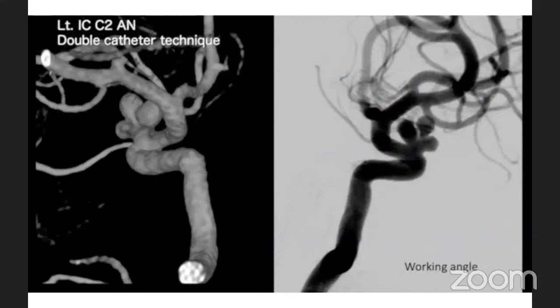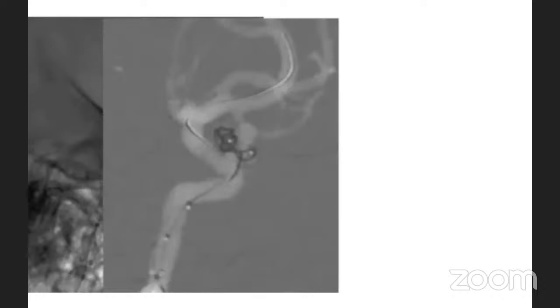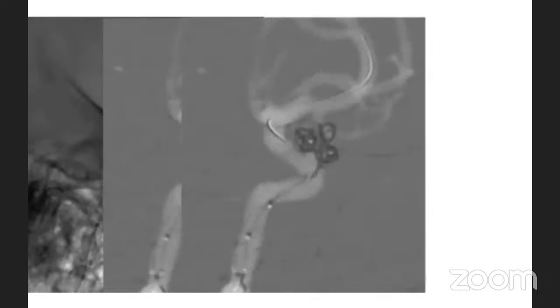This case is unruptured IC paraclinoid aneurysm. The shape was irregular like a clover, so coil framing is very difficult. Double catheter technique is useful for such a multilobulated aneurysm. Two microcatheters were inserted into the aneurysm. The first coil was inserted but still unstable. A second coil was inserted from the other catheter before detachment of the first coil. Stable frame was made with two coils and coil embolization was achieved.